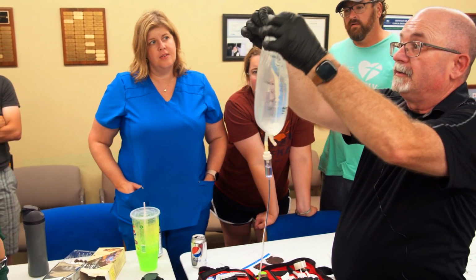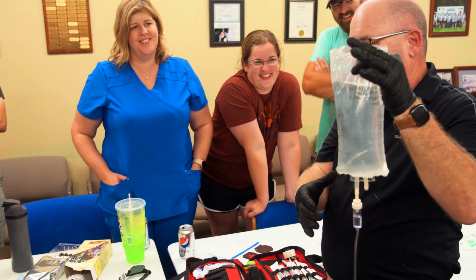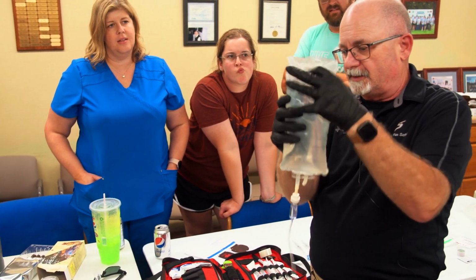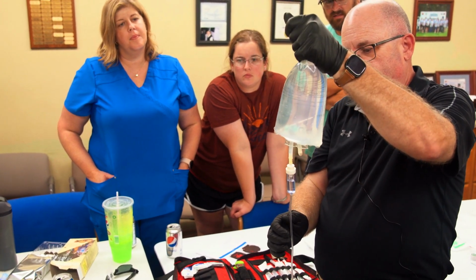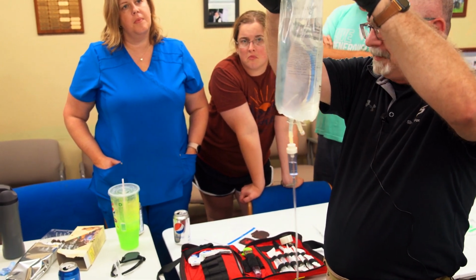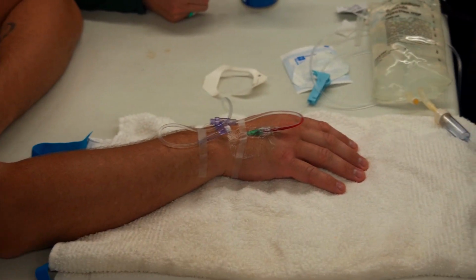So now, when you start to do IOs, pressure bags are pretty important for that because of the marrow. Usually you don't need to, but the pressure bag has a sleeve, kind of like a BP cuff bladder on it, and it'll squeeze on there. For the most part, if you really need to get them a quick bit, we're close to 200 already, 150. There'd be no reason that we would take it out, right? No, once we put it in, it doesn't get touched, usually.